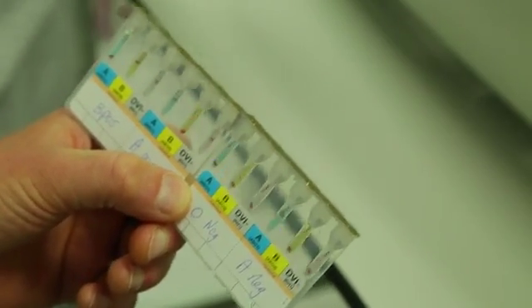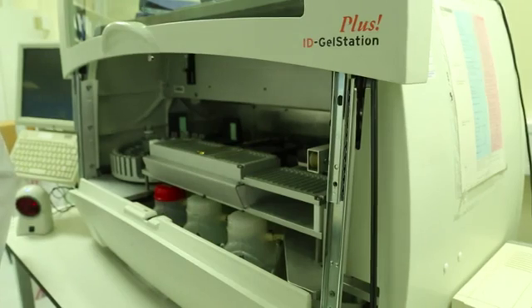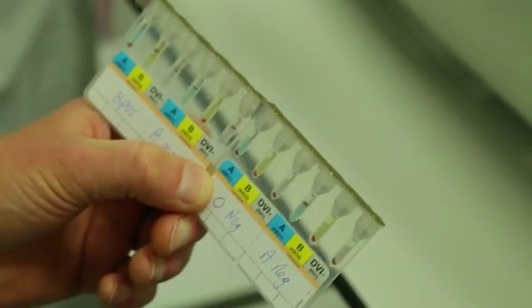Right, well, this machine works on the basis of what we call column technology. I have this card here which has got the same reagents as what we had on the slide earlier in these plastic columns which have got microscopic glass beads in them. When we have a reaction, the raft of red cells are unable to pass through the column when these are centrifuged, and you end up with a button on the top of the column. Whereas a negative result, the red cells are able to pass through the column and you end up with a button in the bottom of the column.